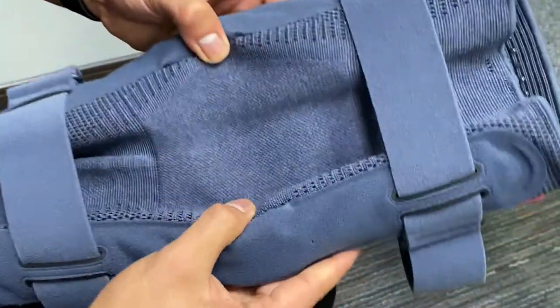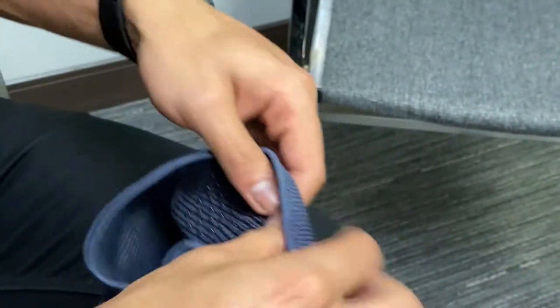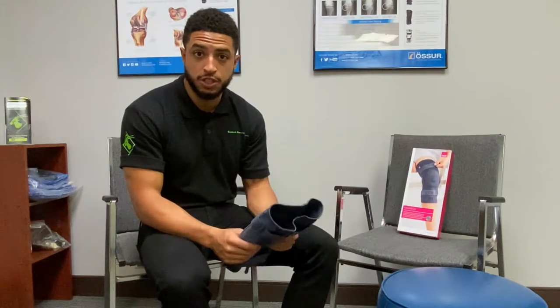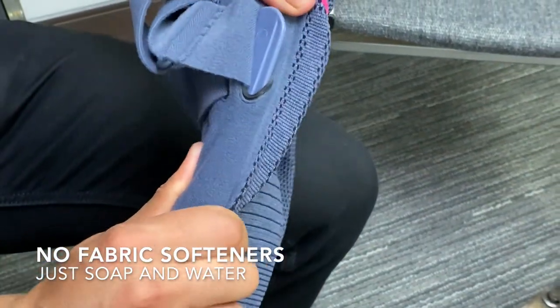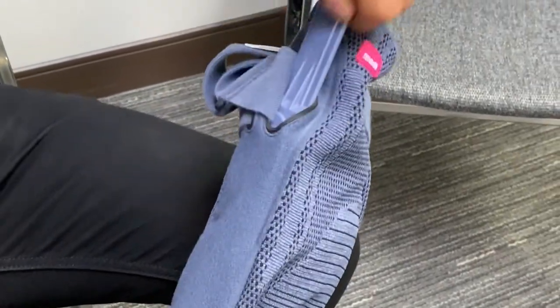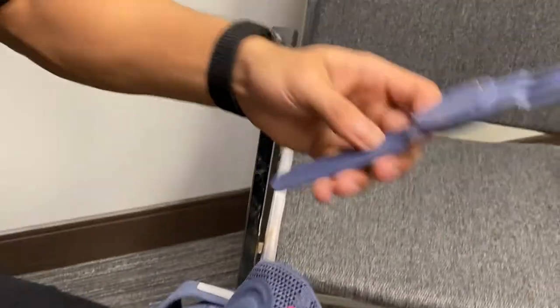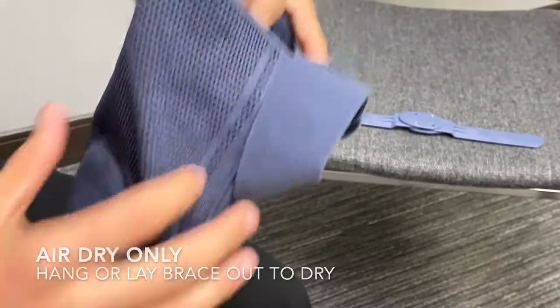To care for the brace, you can always wipe it down with detergent and cold water. If you are going to put it in the washing machine, do not put fabric softener in. And do not put it in the dryer. Go ahead and hang dry it, lay it out, let it air dry — do not put it in the dryer, as it will affect the material.